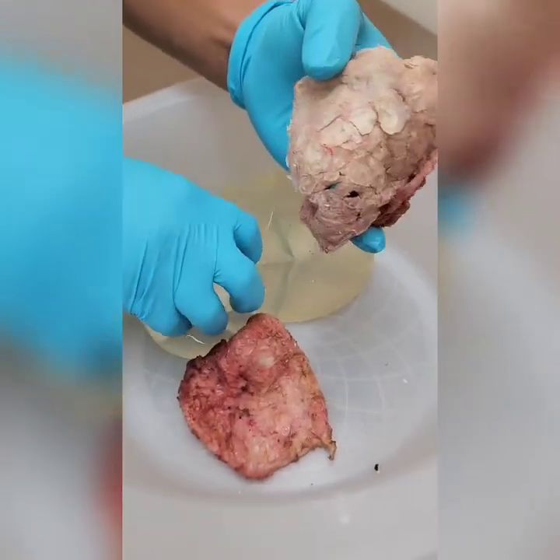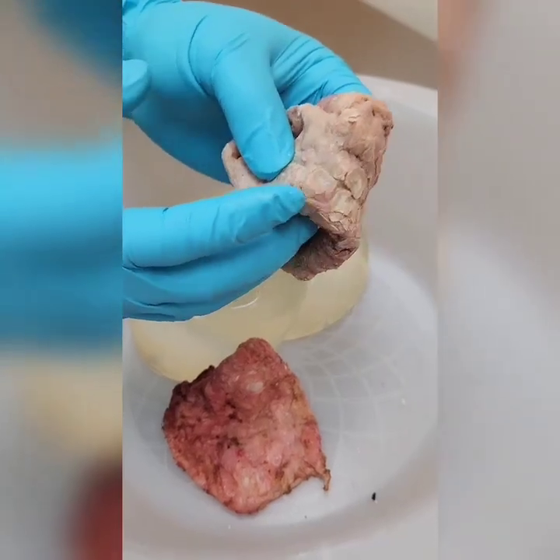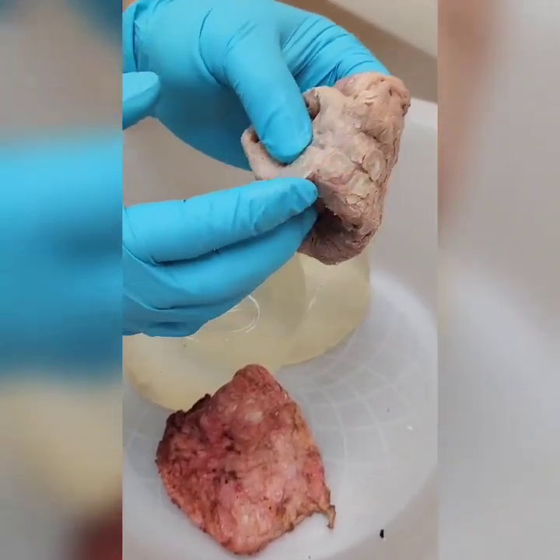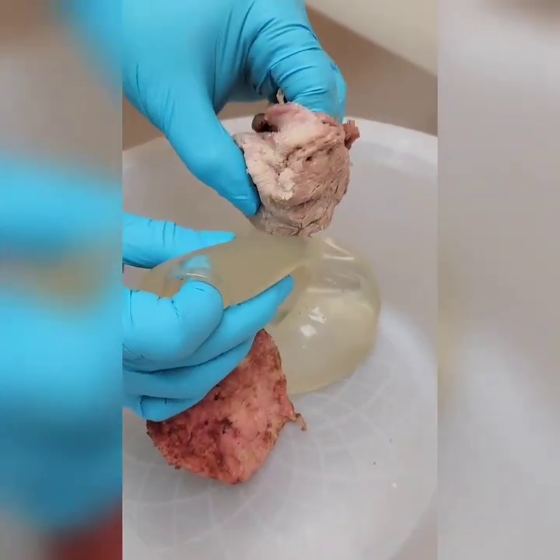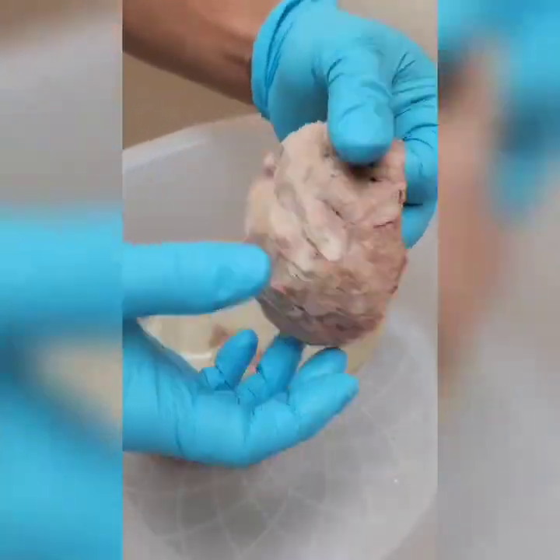So these implants are really indestructible. You can stand on it, it won't break, but look at how sharp these edges are. Is it possible over time rubbing on this will cut through the implant membrane? Possibly, but look at this.